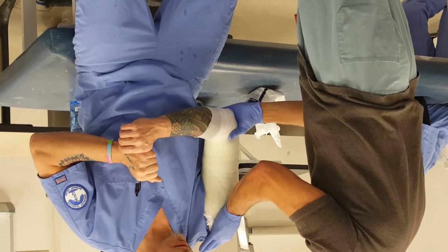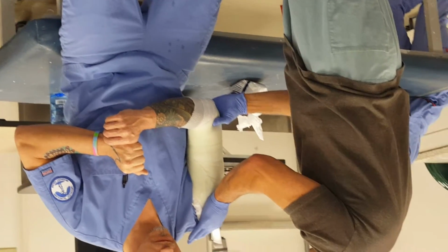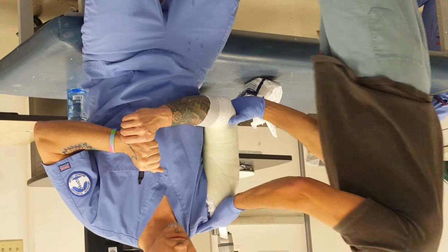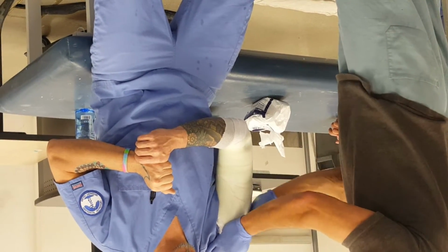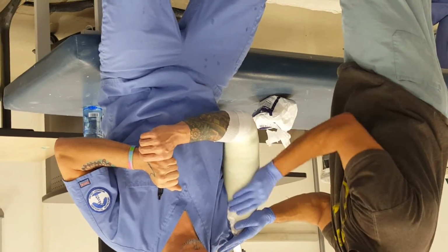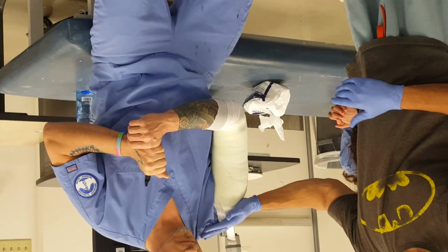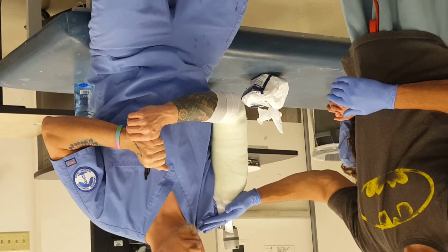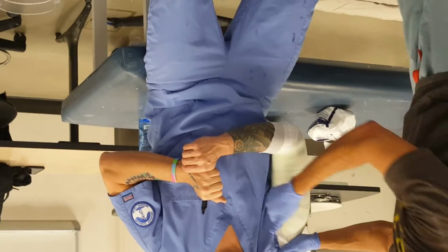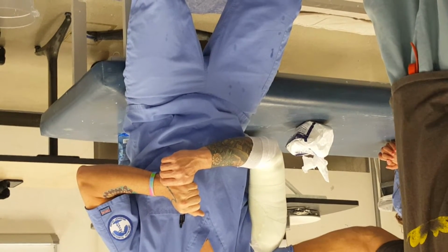Did you capture the epicondyle down there? Couldn't tell. No. I am not molding the olecranon at all. Just the medial and lateral epicondyles. Get used to working with people that can't move. Got it? Very easy for me to take this cast and put my arm out while I trim the inside of that with a saw. Right? In real life, they ain't doing that.